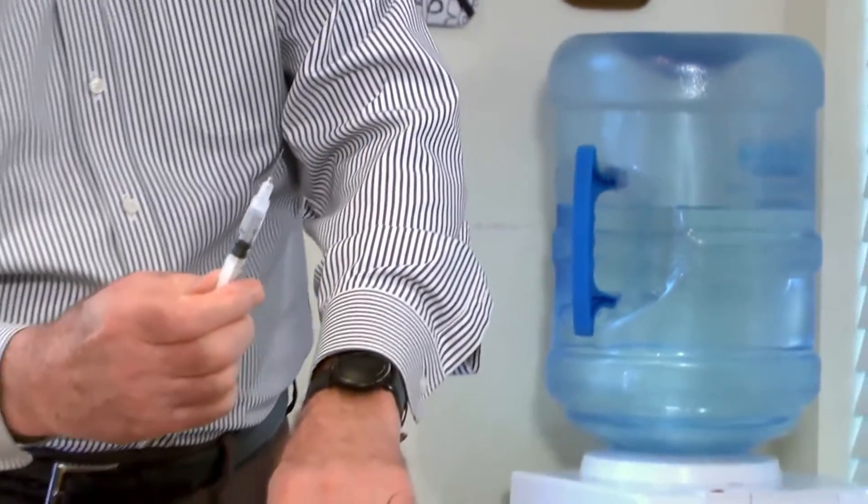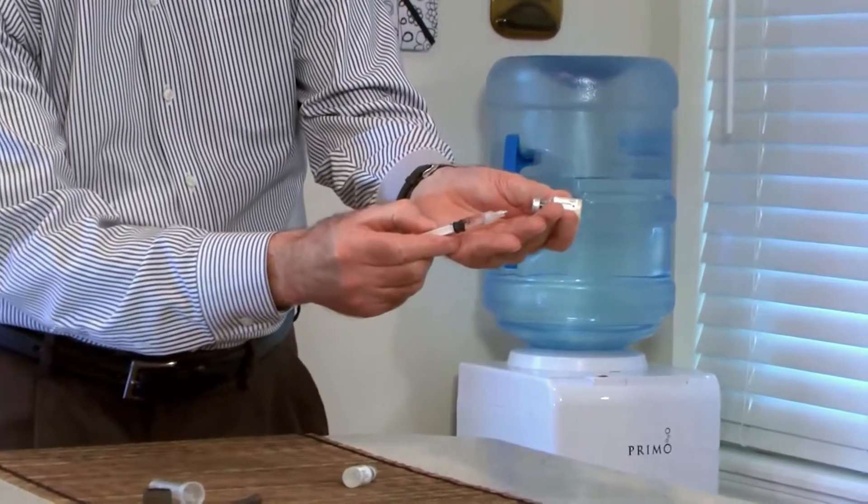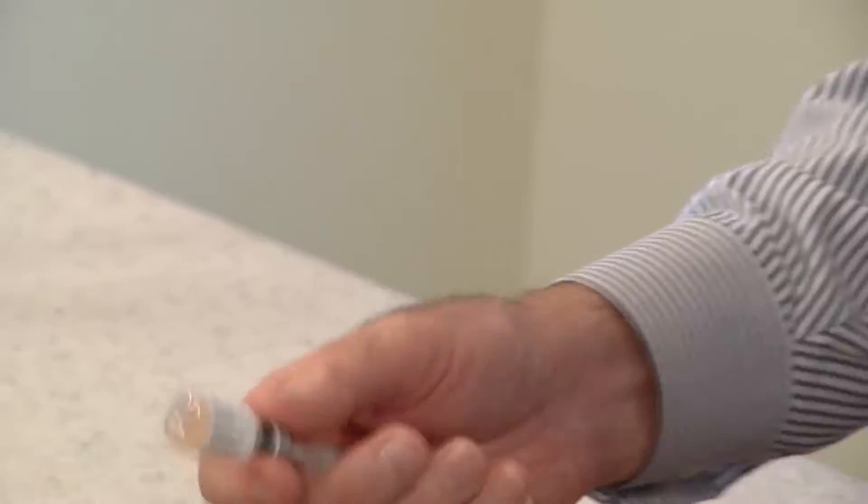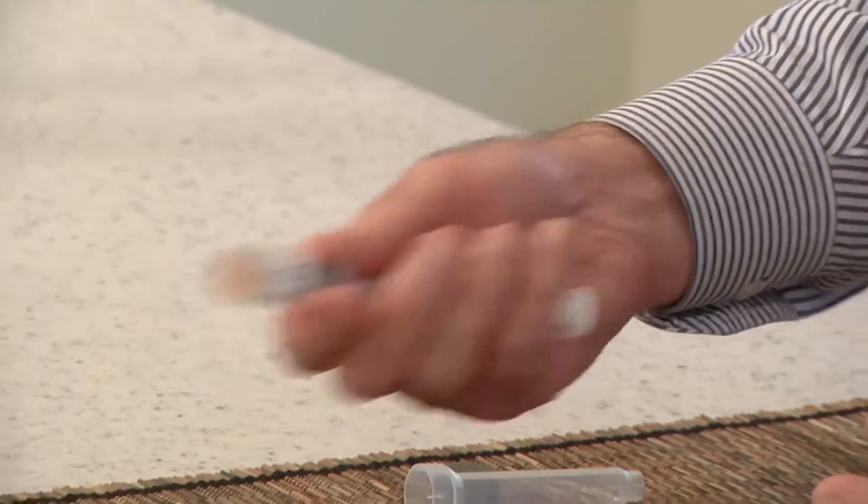Insert the needle into the bottle of dry vaccine cake and push the plunger to transfer the liquid. Shake to mix the vaccine, then withdraw the liquid mixture into the syringe.